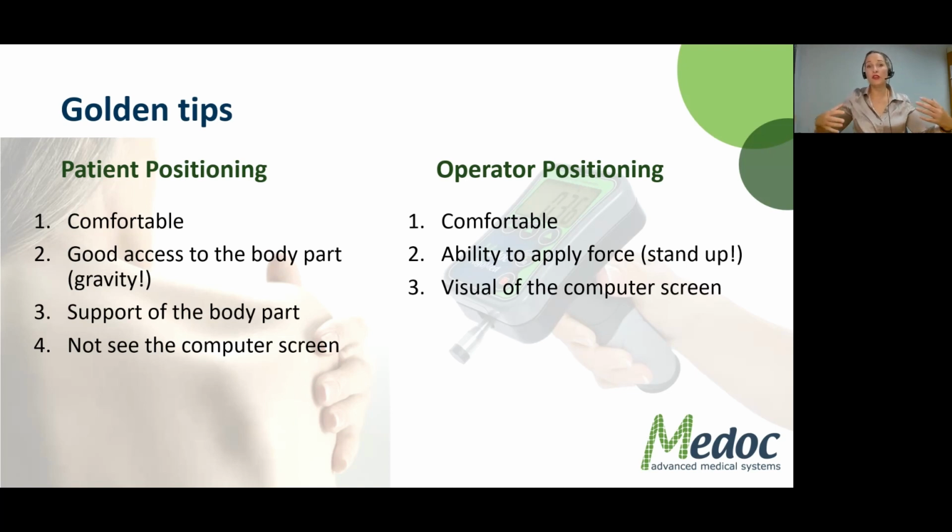You will need to arrange the room accordingly. For instance, if we're going to test my shoulder, then you probably want to move the computer like this. So I will not be able to see the computer, but the person behind me testing my shoulder will. Okay, so keep this in mind when you're setting up your room and your testing space.